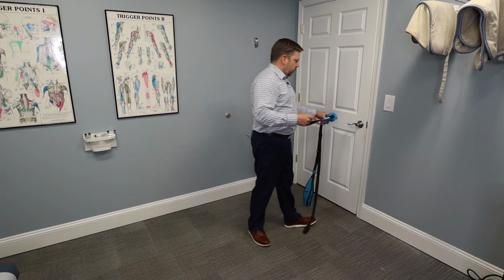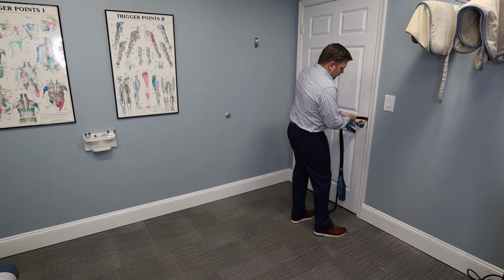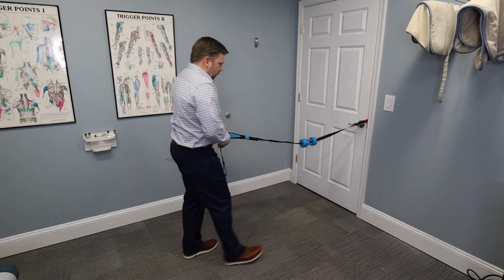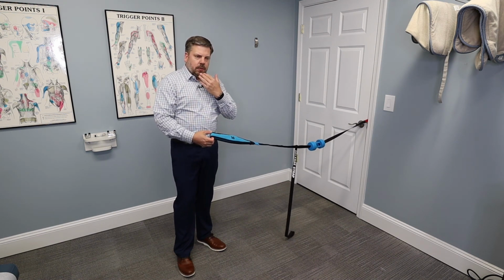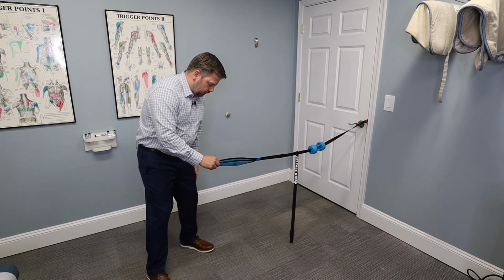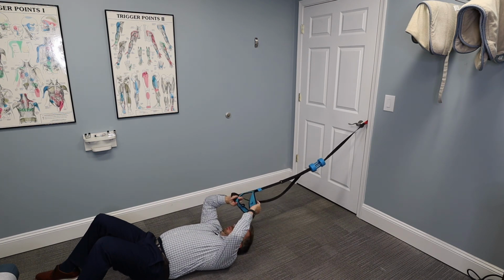Okay, so we're going to secure this around the door. So again, we're going to put the red loop around the door handle here. We're going to put it above the latching mechanism and just pull on it to make sure it's in the right position there. That looks good. So again, what I was talking about before is I want to be positioned on the ground where that portion right here on the end is right between my mouth and my chin. So I'm going to lay down. So this is the ideal position. It should be, again, right between my mouth and my chin, and it is. And then again, there's a right and a left, so we're going to obviously put it on the right and the left side.